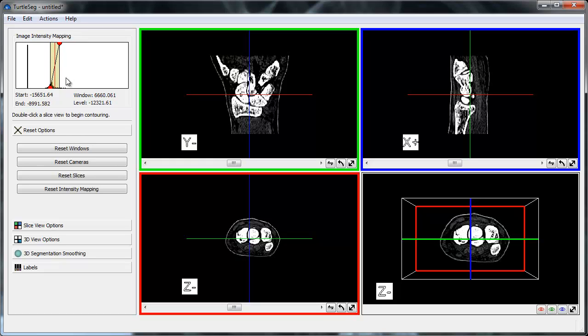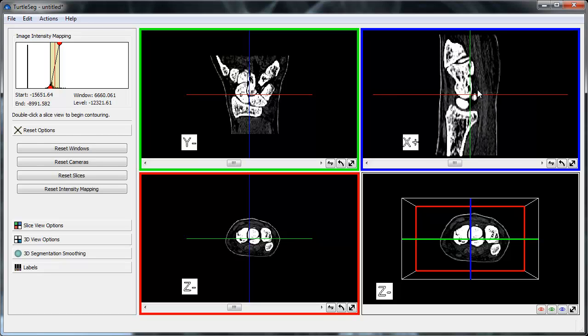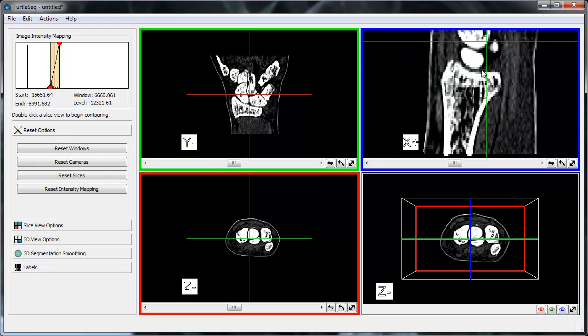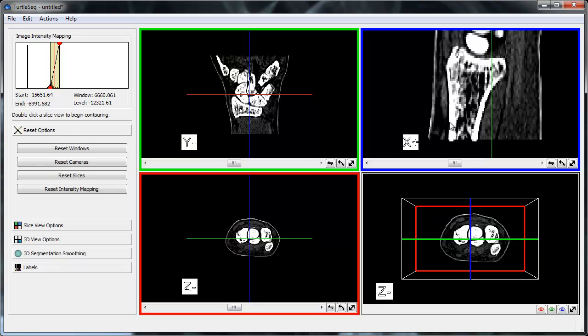In TurtleSeg, objects of interest are identified by contouring around them within a 2D slice. We will add our first contour in the blue, top-right slice view. We first zoom in by clicking and holding Ctrl-Shift-Left-Mouse Button, and then panning by holding Shift-Left-Mouse Button.